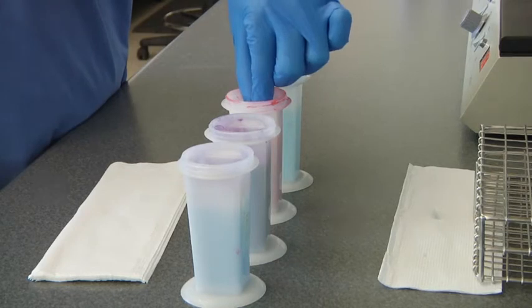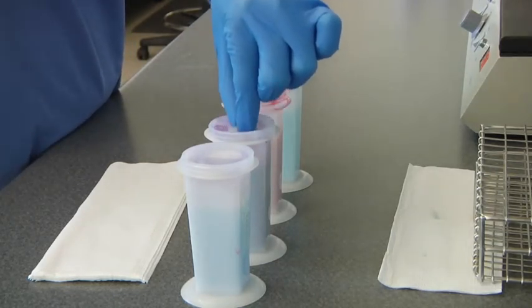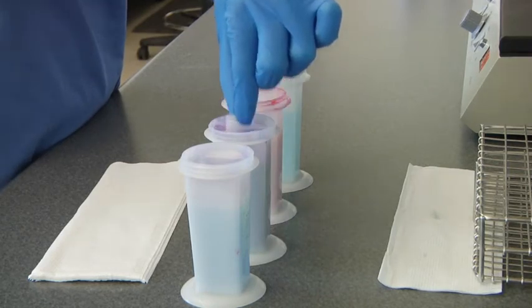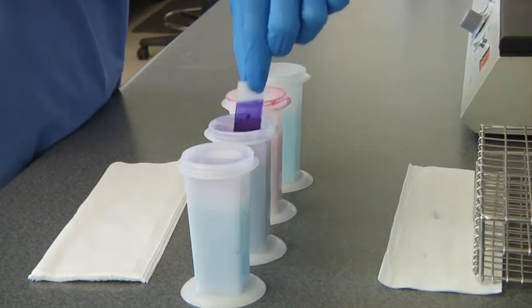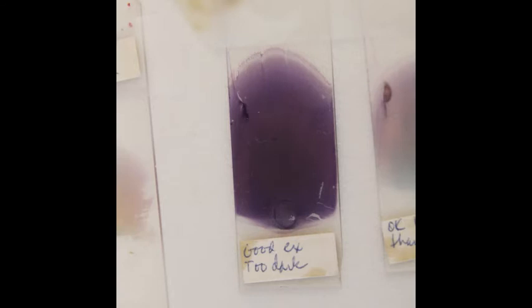When using a quick stain, the pH cannot be controlled, but the staining can be adjusted by changing the slide's exposure to the stain by modifying the number of times the slide is dipped into the stain. When examining the stained slide, if the cells are too pink, you have too much eosin being bound, so the stain is too acidic. Adjust by dipping the slide fewer times in the eosin. If the slide is too blue, the pH is too alkaline, and you can adjust by fewer dips in the methylene blue.